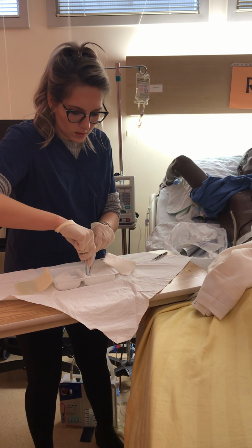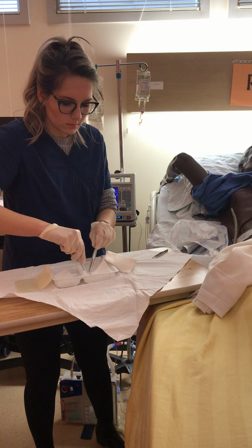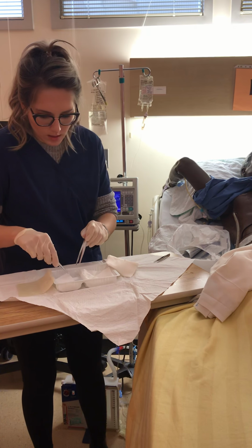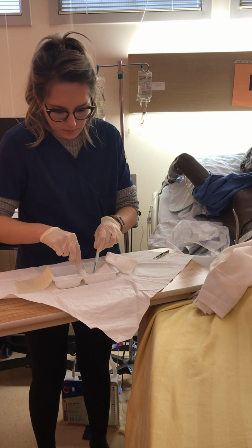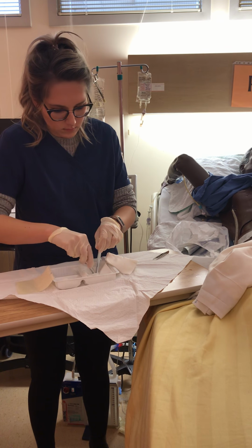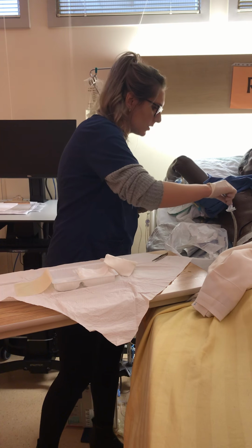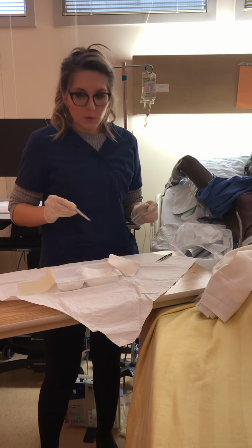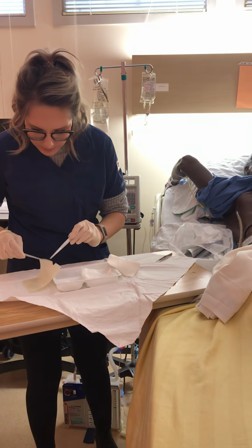Okay, so now I just have to dry it off. Underneath. And now I'll just do the top of the tube. Okay, so top of the tube is done. Okay, so now that that's done, I'm going to do my jelonet. So I'm just going to take my jelonet here.